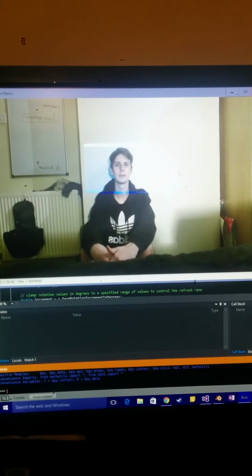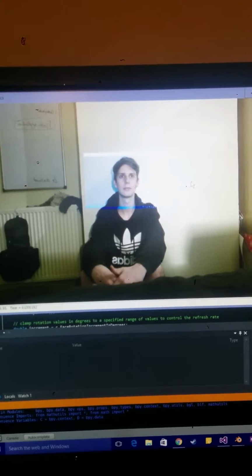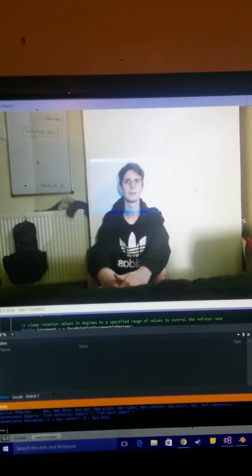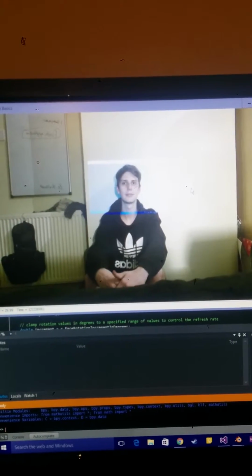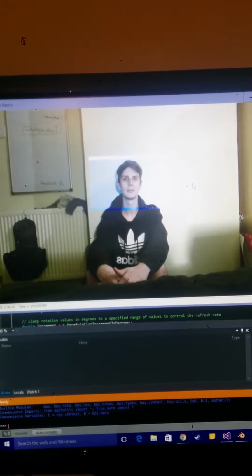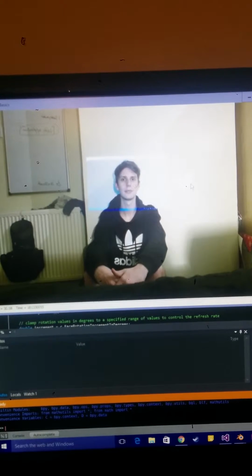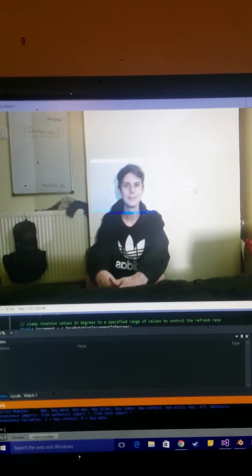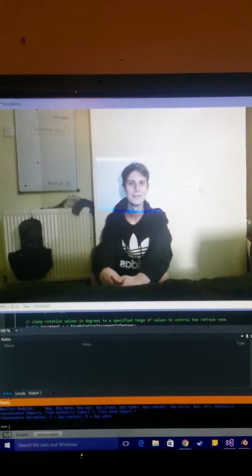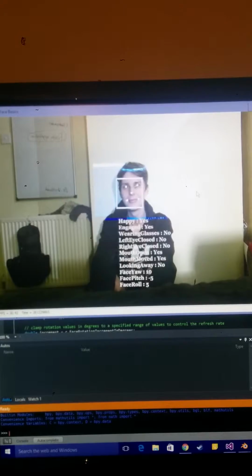Upon the Face Basics augmented Face Basics software running, you will notice the camera screen comes up and viewing the patient. The Kinect has not managed to identify the patient. Currently, this is due to a lack of movement. So if I ask the patient to just move his head slowly forward towards the Kinect camera, a little bit more, or move it left and right. There you go, and the Kinect has now successfully identified the patient.